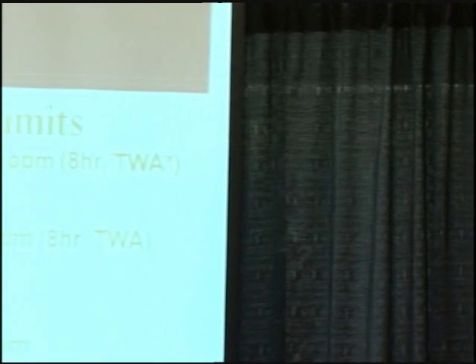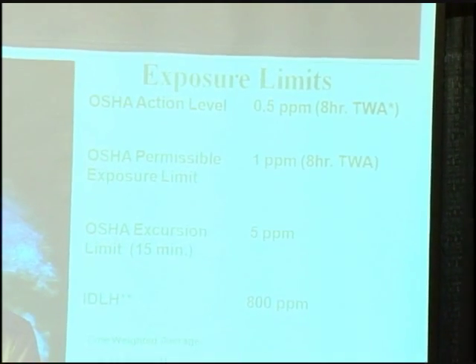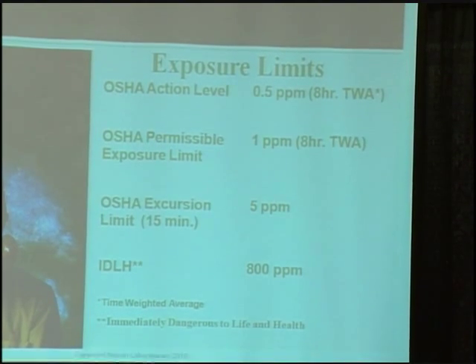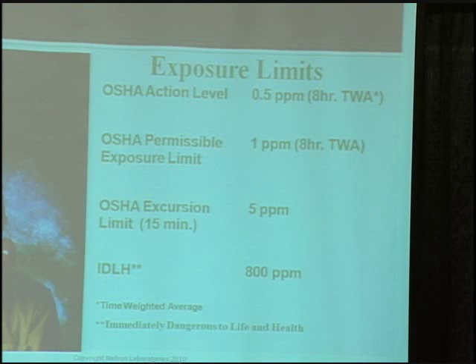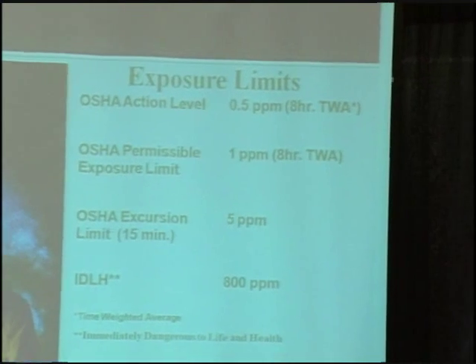It is toxic, which is one of the things that makes it a great sterilant. So OSHA has set limits on the worker exposure. If you're going to be around it, you have to be cognizant of these levels. It has a permissible exposure limit of 1 part per million, which is pretty low, but it is a toxic compound, so you do have to take precautions and do monitoring if you're working with ethylene oxide. But because it has been so widely used, it's probably one of the most widely studied chemicals out there.